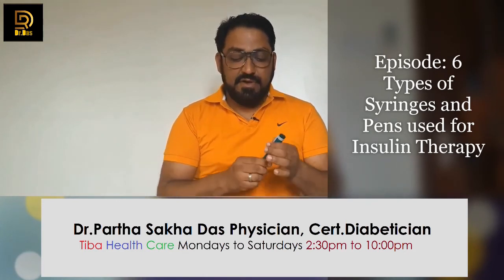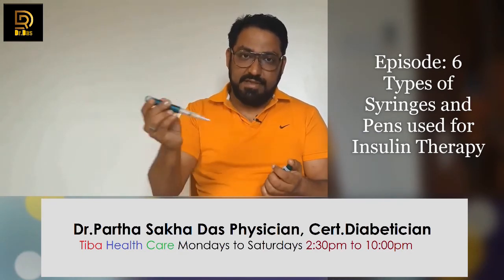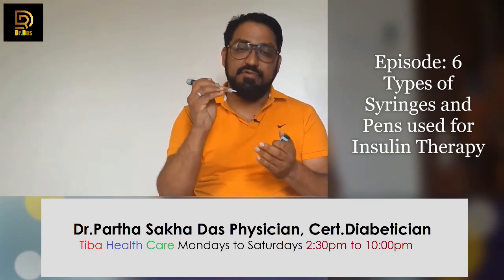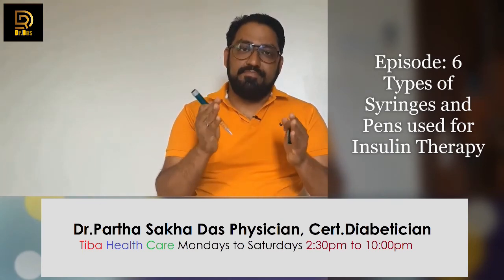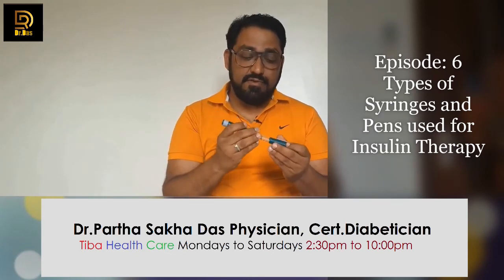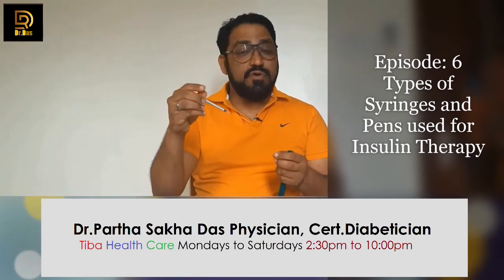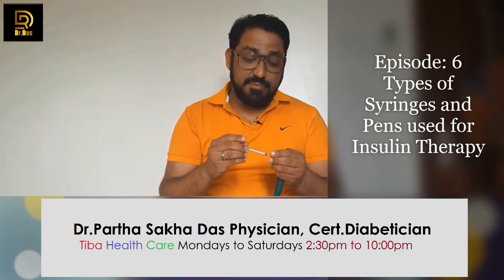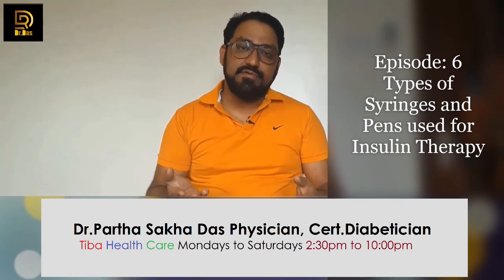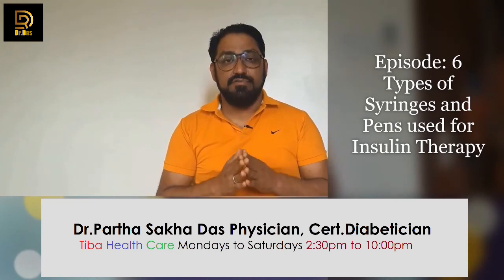Second thing is, because the needle is so small, it doesn't matter how you inject. Usually you're supposed to inject at a 45-degree angle because the insulin needs to reach your subcutaneous layer, not the muscle layer. With the pen, it doesn't matter how you're injecting, it will not reach the muscle layer. While with the syringe, because it's bigger, if you do not know how to inject and it reaches the muscle layer, it absorbs very quickly and gets destroyed. So even after giving the insulin, if you see the sugar is not controlled, that means you are not giving the insulin properly.